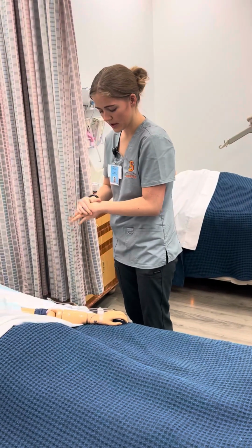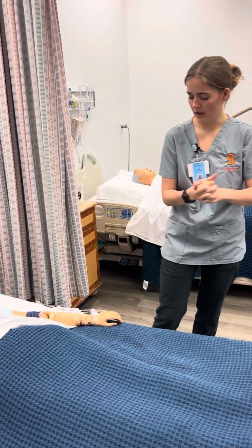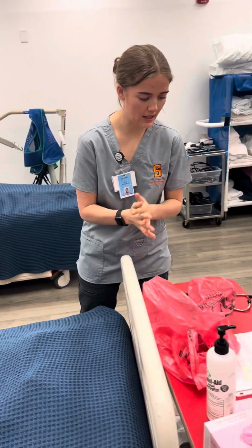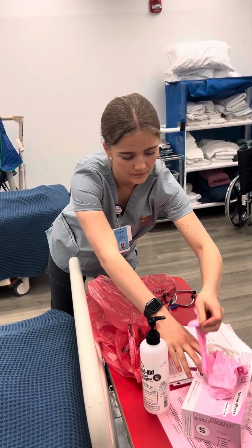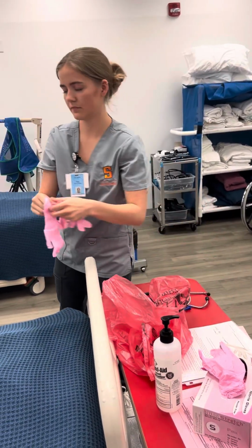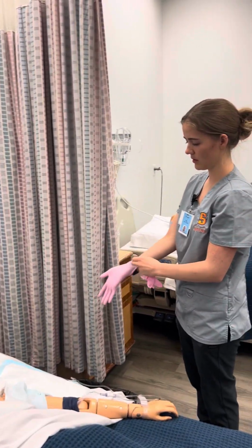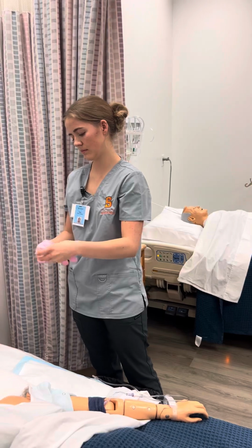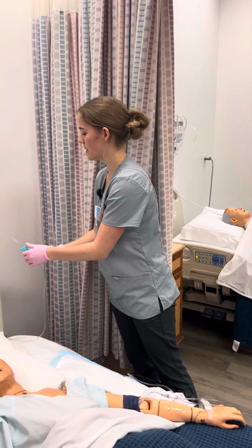And then I'm also, after that's done, I'm gonna just flush my line with saline. So I'm gonna go ahead and just clamp off my blood.